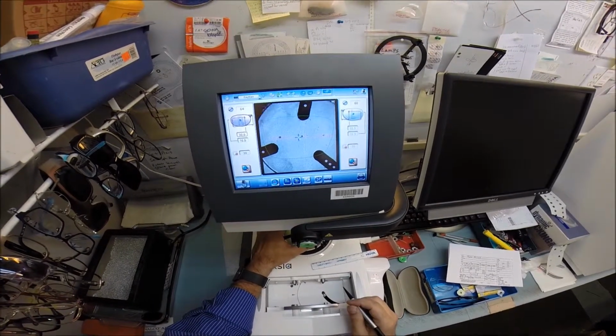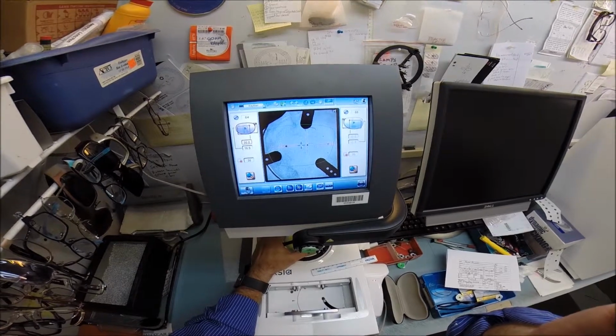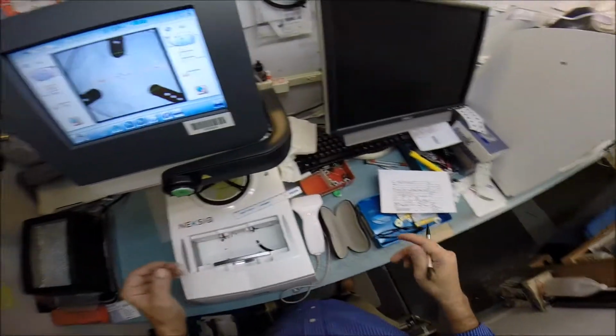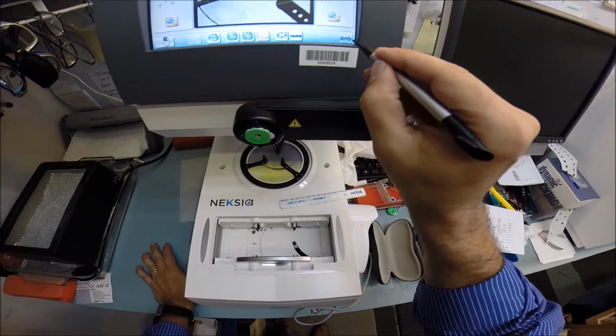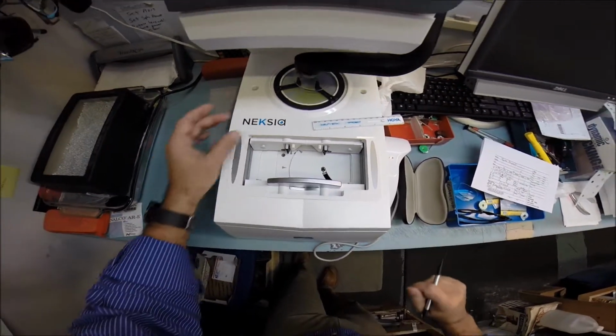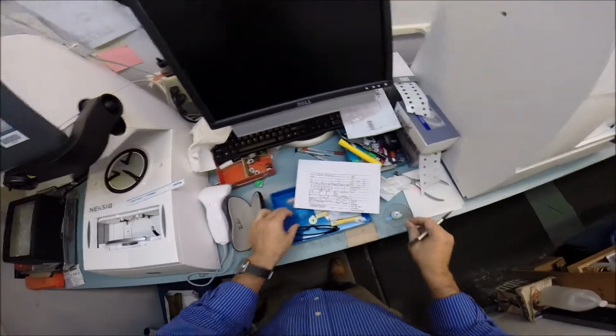The reason why I put those 3 dots on there is that it lines everything up on the horizontal meridian to make sure everything goes in there perfectly. And I'm going to hit this button, and that will drop the lever down onto your lens. That has now attached the block. I just pressed that on there to make sure it's on there firmly.